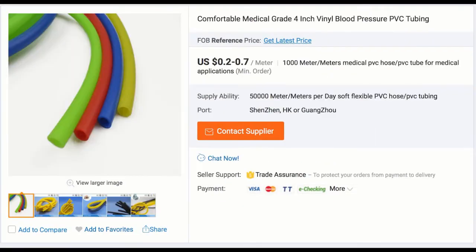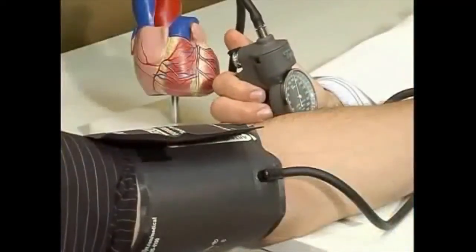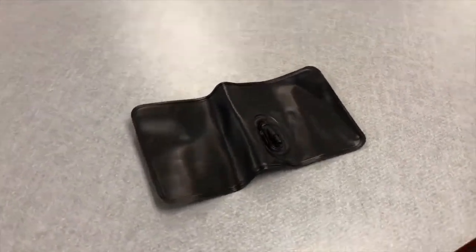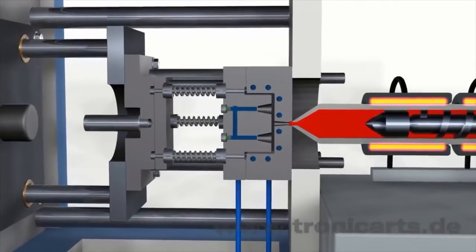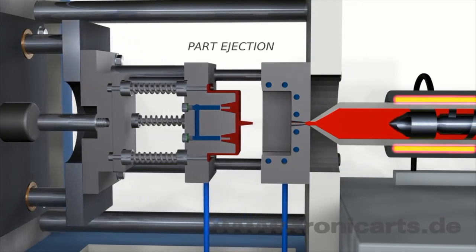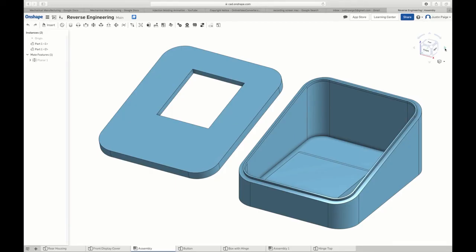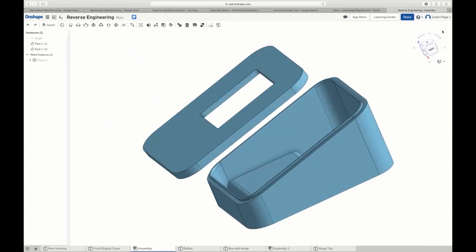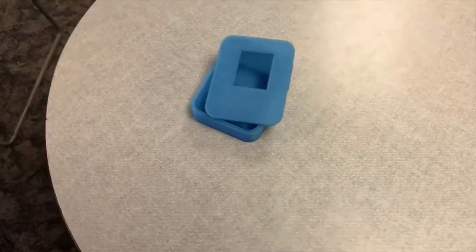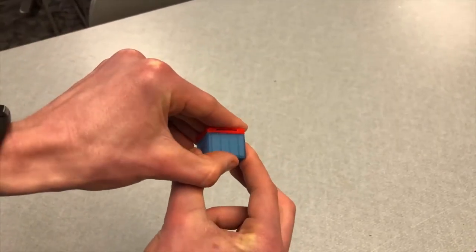The blood pressure cuff can also be ordered in mass quantities, but has an interesting manufacturing process — it is made by heat sealing two rubber sheets together to form a flexible band, with a tube fitting incorporated into the sealing process to provide a connection for the air supply. The housing of the monitor is made through injection molding: liquid plastic is injected into an empty cavity, the external mold is removed to reveal a complete part, and draft angles are used so the part releases easily. The monitor can be modeled in CAD such as Onshape and 3D printed as proof of concept, then uploaded to a site like Protomold for a free quote and injection molding feedback. Buttons can be made with thin plastic attachments for pressure, and teeth can be put on the housing to allow for a snap-on fit.